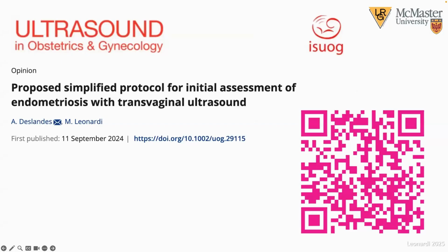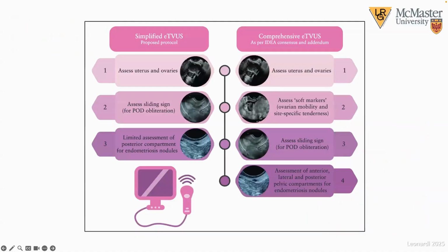So myself and a sonographer from Australia, where the system is actually quite similar to our Canadian, we proposed a simplified protocol for the initial assessment of endometriosis. This is less complex than the IDEA approach, involves slightly less structures, shorter duration of time. We believe this to be much more high yield.